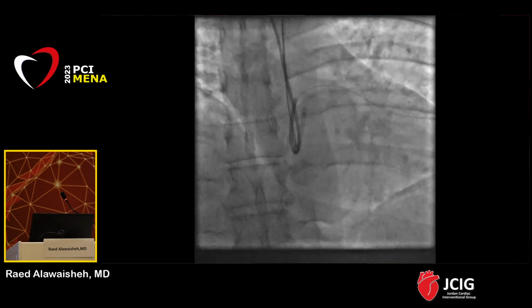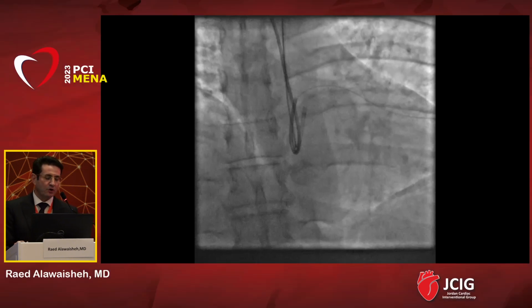The microcatheter, actually the tip of the microcatheter, is here. So you need sometimes to explore, or to externalize not only the wire, because this is the ipsilateral technique, and you need to go with the ping pong technique. So it's better to go with the microcatheter down to the aorta there. So it's easier for you to get the wire there, and from there to try to go to the tip of another guide. And when you go with the ping pong technique, it's preferable to use another guide, another shape.